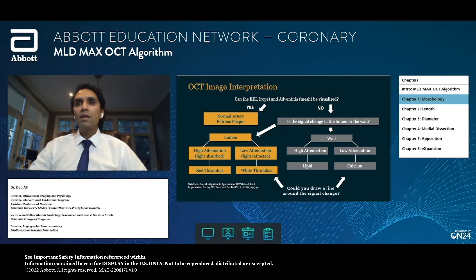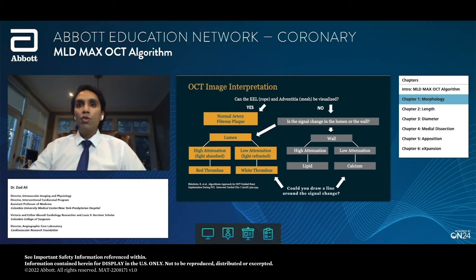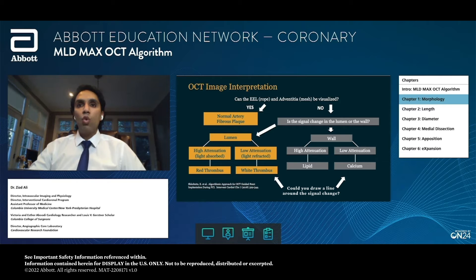If we keep this in mind, essentially everything you need to know about OCT-guided image interpretation is present on this single slide. Anytime you see any OCT cross-section, ask yourself: can you see the external elastic lamina, the rope, the adventitia, and the mesh? If you can see the external elastic lamina or the adventitia — the rope or the mesh — the artery is either normal or fibrous. When you can see the rope or mesh all the way around the artery, it's an excellent place to land your stent.